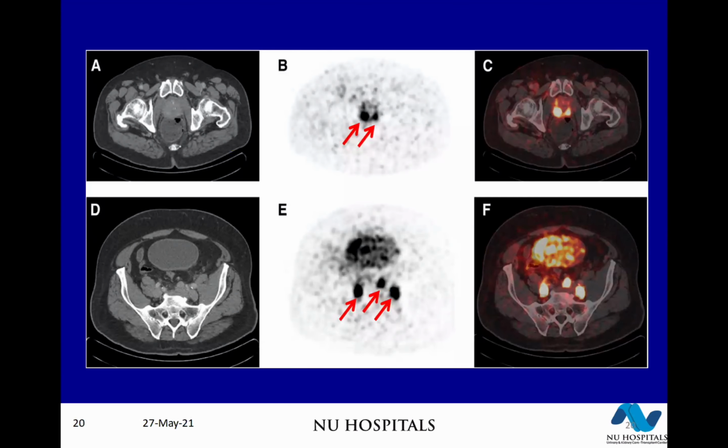Karnakar, can you go back to the image, please? Sir. D, this is just a warning for residents. If you see here, there are several soft tissue lesions or shadows which are not normal. Yes, sir, they're all merged into each other. So here the use of the PET scan is in knowing the significance of these. The lesions have to be recognized at CT. I would be unforgiving of myself if I didn't pick these up on CT or MRI. This is not the normal pelvis. Maybe to increase the diagnostic accuracy. Correct, and to know what they are. Yes, sir.